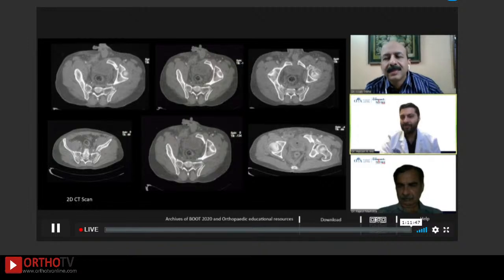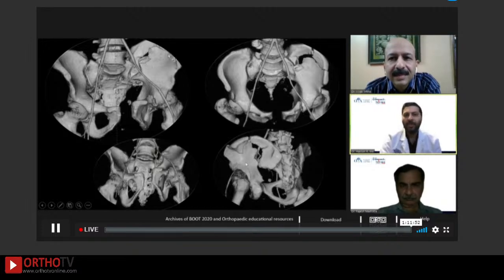And because your iliosacral screw here wouldn't really capture the unstable portion. Also, probably plate fixation or screw fixation up along the ilium there. And then I agree with Paul on the front, two implants, one for the symphysis. And then I would probably do a ramus screw as well.